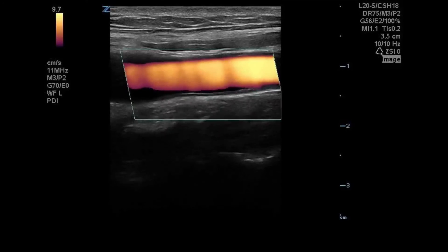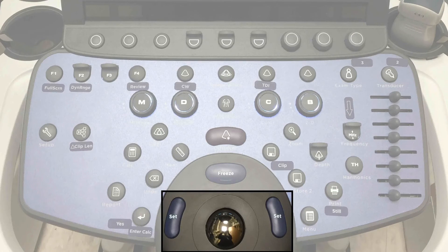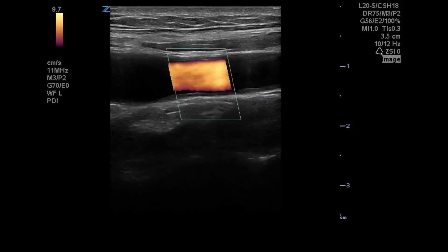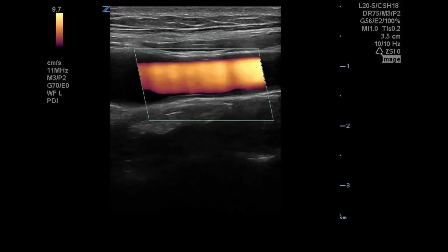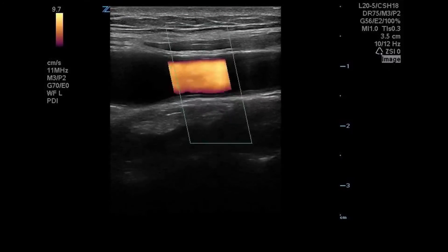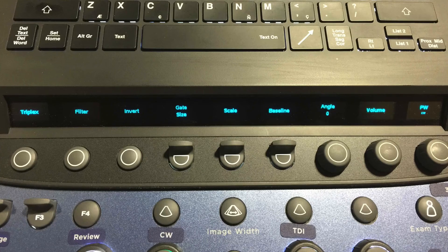You can see we have switched to power Doppler imaging of that blood vessel. To move the box, use the trackball. If you press the set key you will be able to change the size of the box with the trackball; pressing set again will allow you to move the box. You can then activate spectral Doppler.